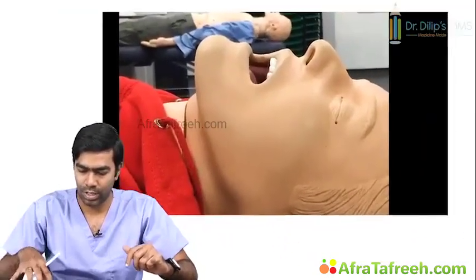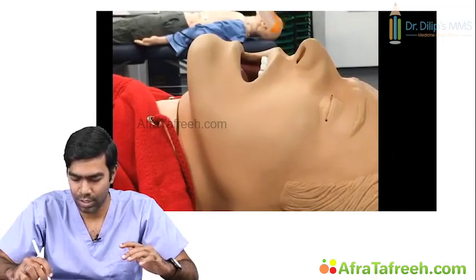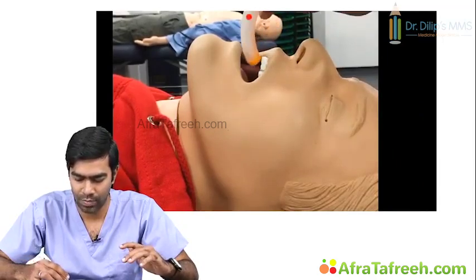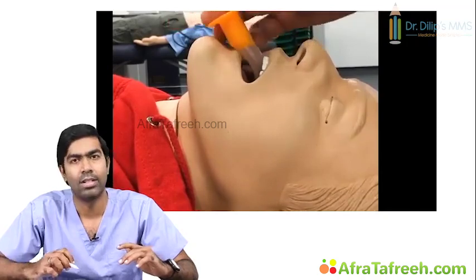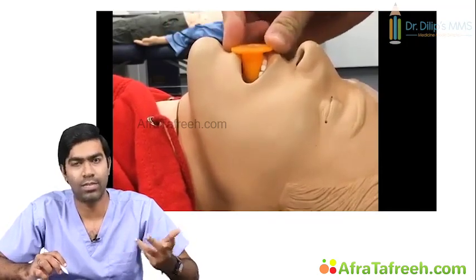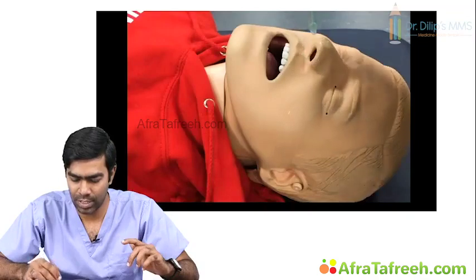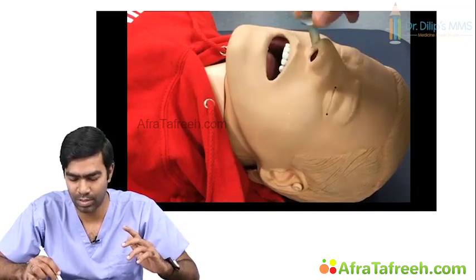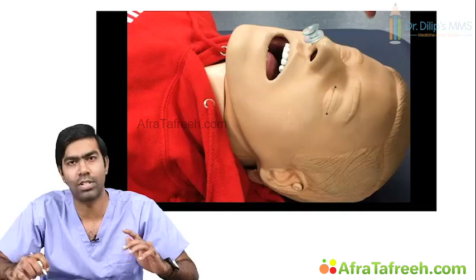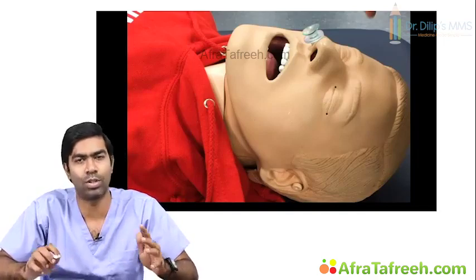Okay, now let us see how you are going to insert these basic airways through this particular video. So here first we'll see how you are going to insert the oropharyngeal airway. You can see now the convexity is facing towards the tongue or towards the base of the mouth. Once it hits the palate, you rotate the airway 180 degrees, which results in smooth insertion. Now you can see the nasopharyngeal airway. You can see clearly the bevel is facing the septum. This slanted end is called the bevel, and that's the only technical point you have to know. Otherwise it is smoothly inserted into the nose. So this is how you insert a nasopharyngeal airway. Both are very easy to do.